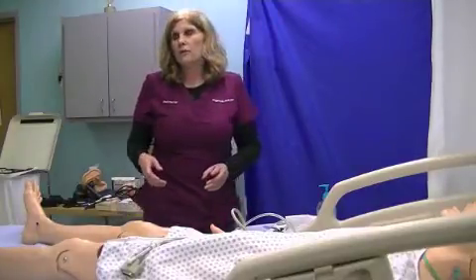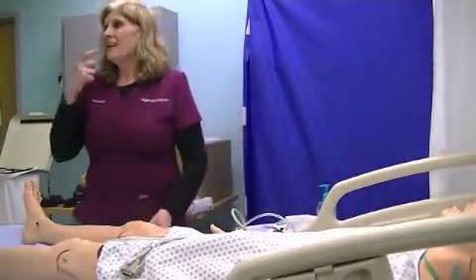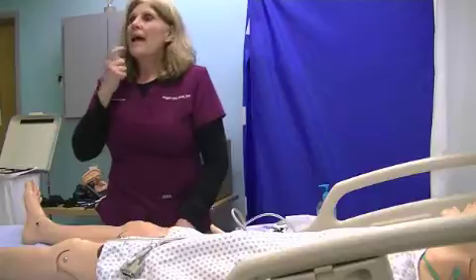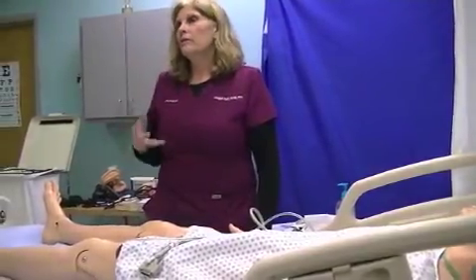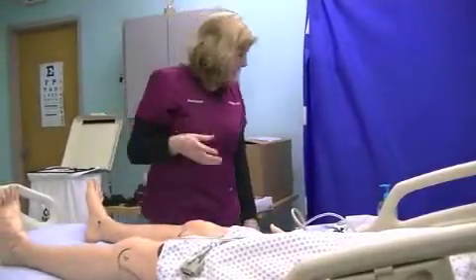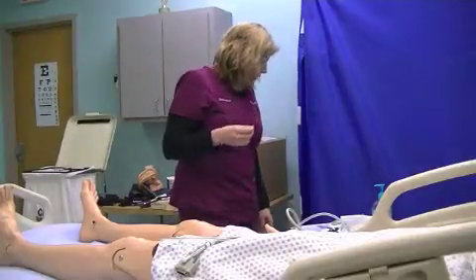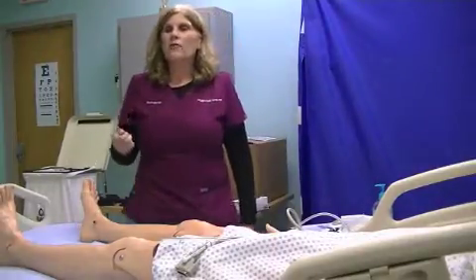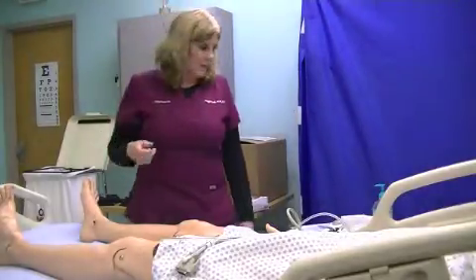that they're not unconscious, because an unconscious person cannot make a tight seal with their lips. And if you don't make a tight seal with your lips when doing an oral temperature, you won't get a good reading. You're probably going to get a false low reading. Also, I'm going to make sure they're not a mouth breather, and if they can't hold the thermometer, that's not the best method for me to use. So then I would take an axillary temperature.